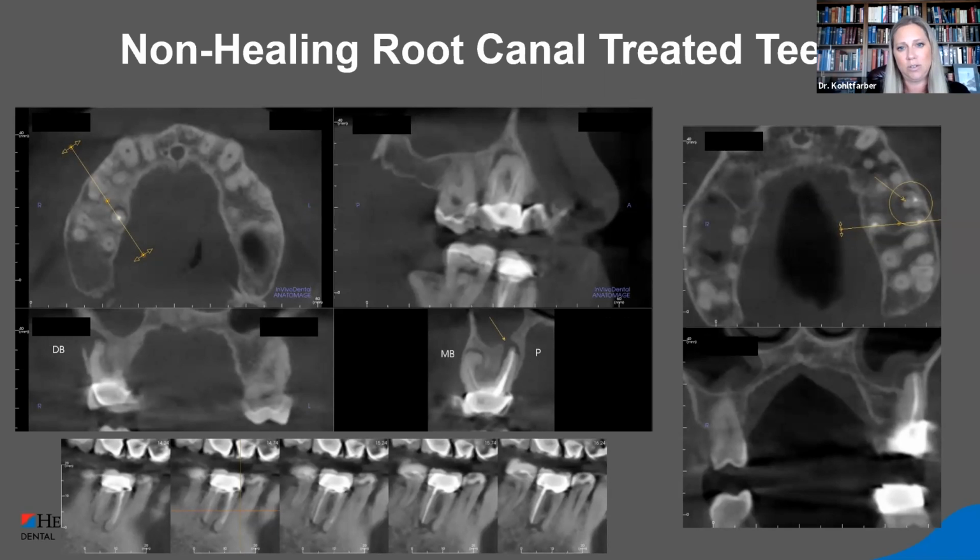The patient has continued symptoms. And I can't figure out why based on that 2D imaging. So that's really what pushed me into 3D imaging. But again, being able to see between the cortical borders, now we can see, yeah, there is a continued periapical lesion. Here we've lost the inferior cortical border of the sinus.